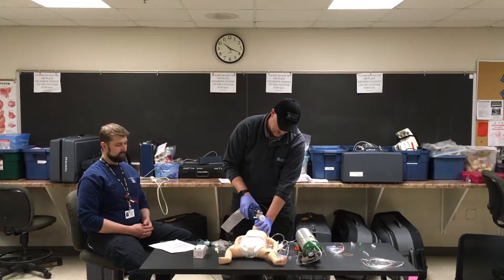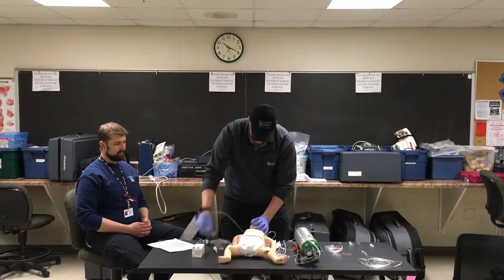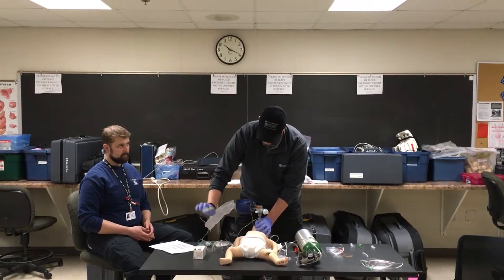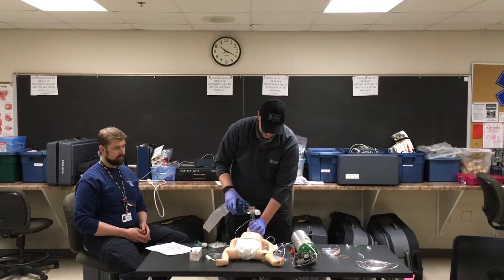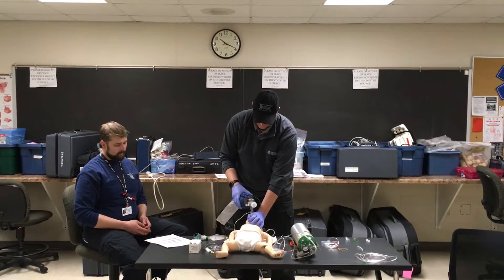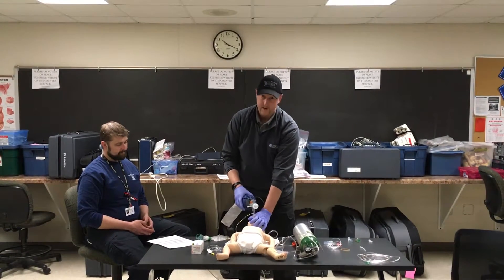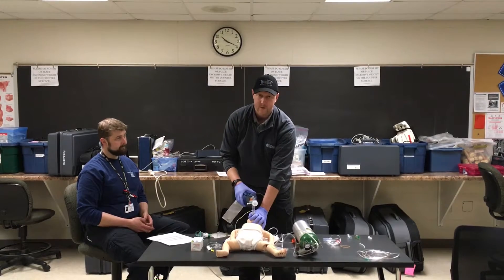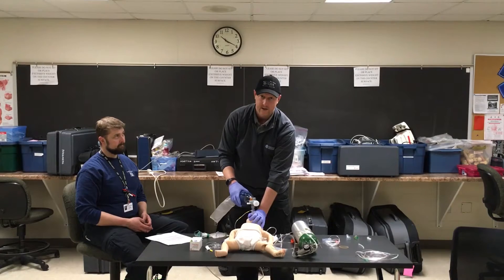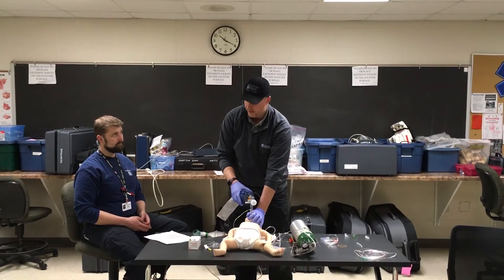While we're observing for chest rise and ventilating one breath every three seconds, we can go ahead and insert our capnography — hooked up to our LifePak 15 or LifePak 12. To know that we're ventilating the patient properly, we look at SpO2 — we should see an improvement. We should also have an improvement in capnography, an improvement in skin color, temperature, and condition, as well as level of consciousness.